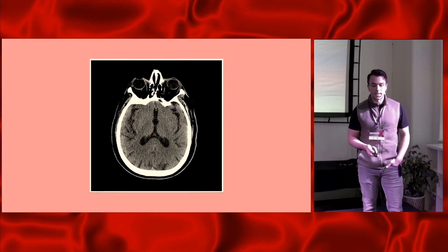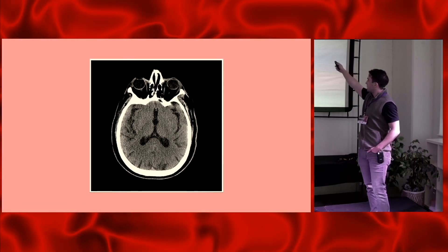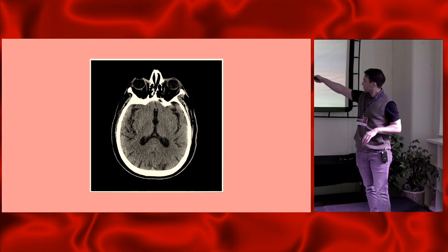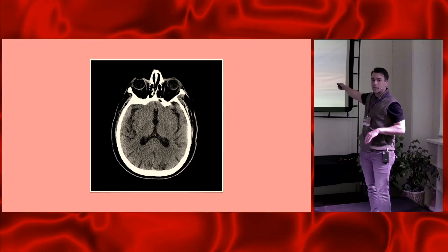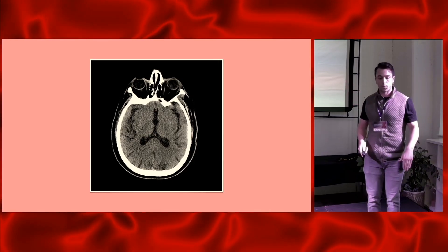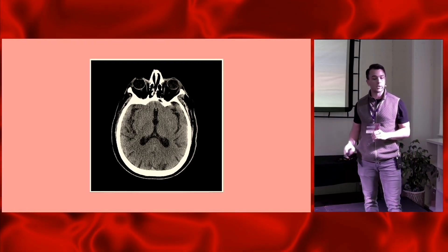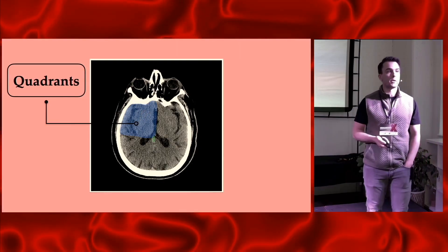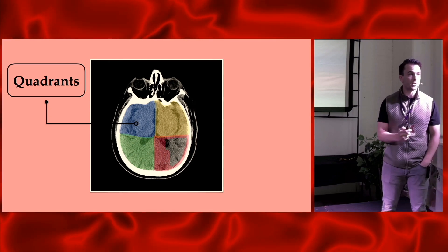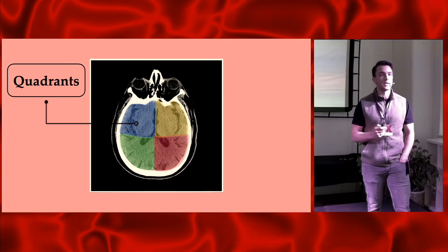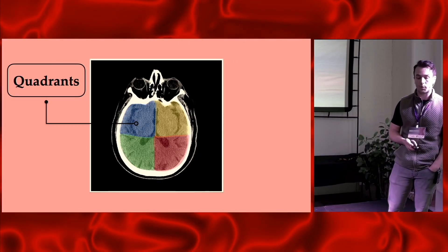On an axial CT cut, the top of the screen is the front of the patient's face, the left of the screen is the patient's right side. You're imaging from the patient's feet up to their head as you scroll through. I like to use the quadrant approach: break the brain into quadrants, scan back and forth, and compare both sides to see if they're similar — looking for differences, mass effect, or effacement.